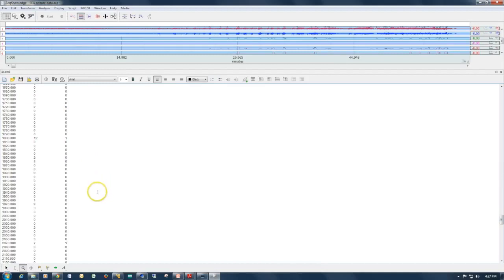If we scroll down, seven were counted here, and that means that a 1 is placed in the seizure identification column. You can see here are some others. Okay, so that gives you a quick run through.